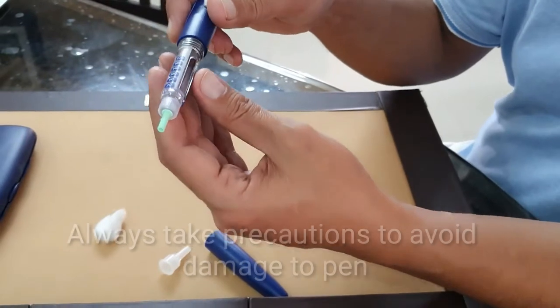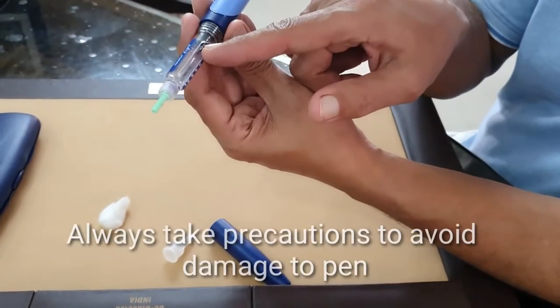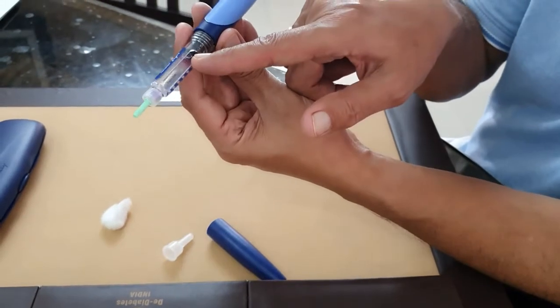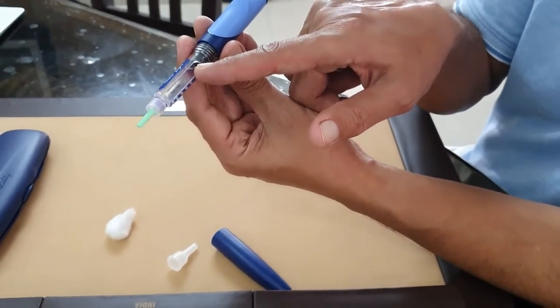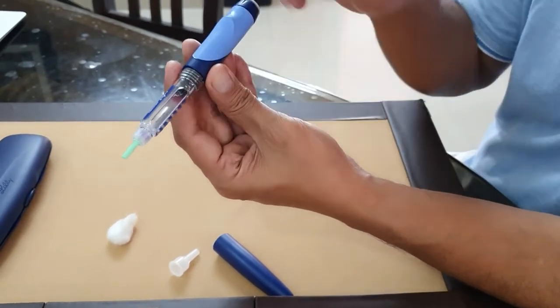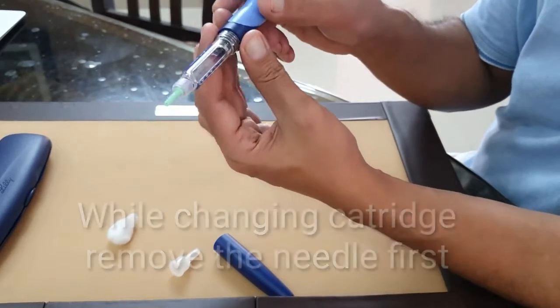Don't let it fall - if it falls down it can break and you may not get the actual measure of insulin while injecting. Once the insulin is reducing, the cartridge quantity reduces. You can see a black rubber piston which moves towards the end.